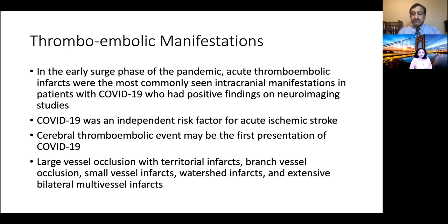We saw thromboembolic phenomenon in the form of large vessel occlusions with territorial infarctions, branch vessel occlusions, small vessel infarcts, watershed infarcts, and extensive multi-vessel infarcts bilaterally.